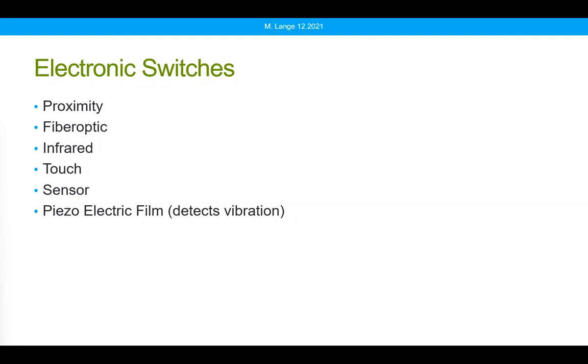First, you can spend some time just helping the person get used to the switch. They can feel the switch, perhaps they can see the switch depending on where it's mounted, and they can see the effect of the switch. Like I'm moving my power chair, or I'm now seeing my scan on my communication device, or I've heard my selection from my communication device. So there's other feedback that's available that might help this person compensate for lack of auditory feedback.